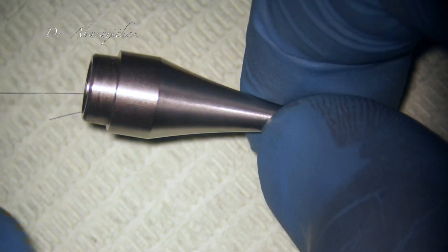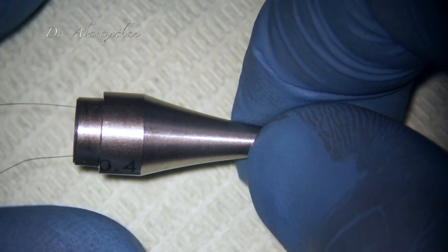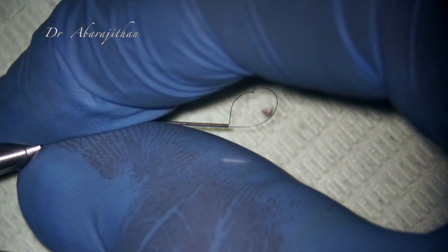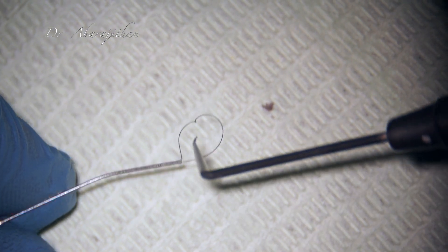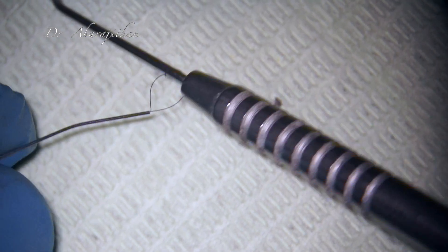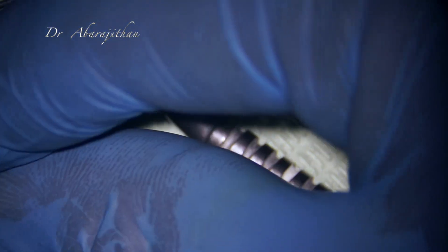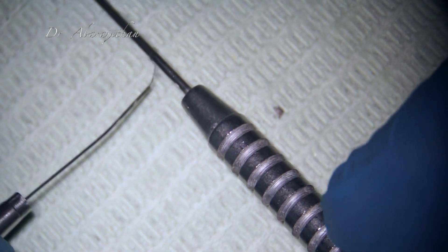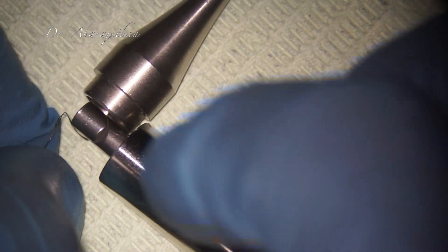Both free ends can now be pulled from the rear end, but we should also make sure the loop is retained — it should not get pulled through. Here I am using a DG16 probe; we can use any probe or small metal instrument to make sure the loop is not lost. Now we can secure the free ends at the back of the needle to the cartridge.